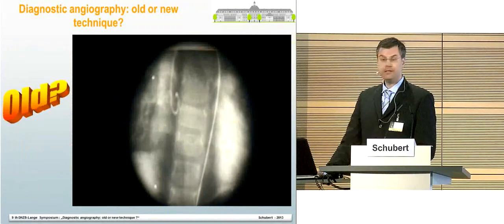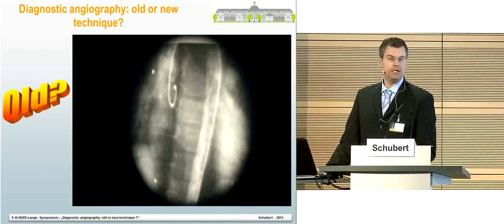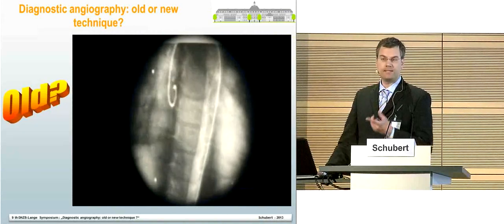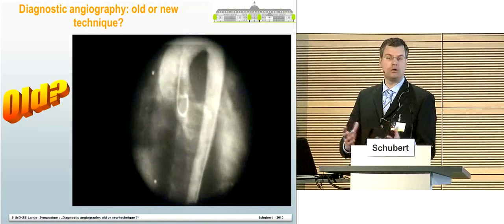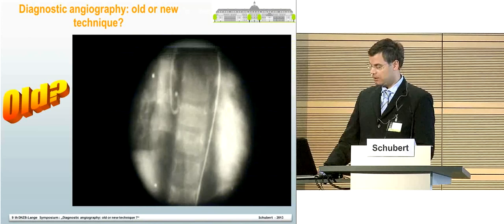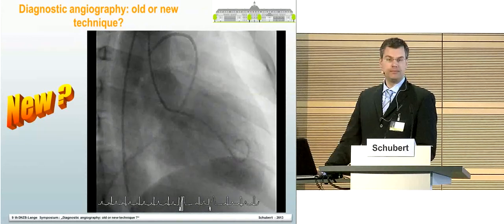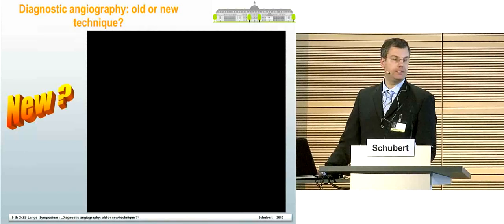If I go further on, I show you this angio, and I'm not sure if it's really an old angio. The method, maybe the technique, is the same. We have a catheter, putting inside the vessel, giving contrast or dye, and have a picture of the vessel, maybe in 2D. What is missing here: this is a lateral projection, but this is the AP projection. This is today. The old angio was from 1994. This is today. I think it's quite the same.